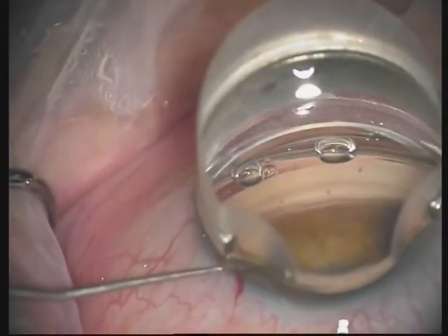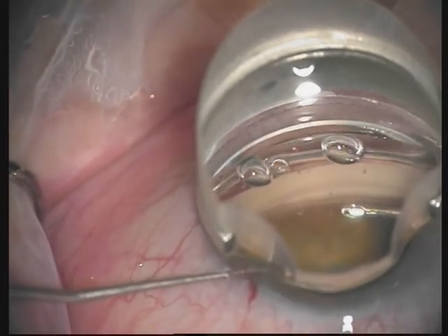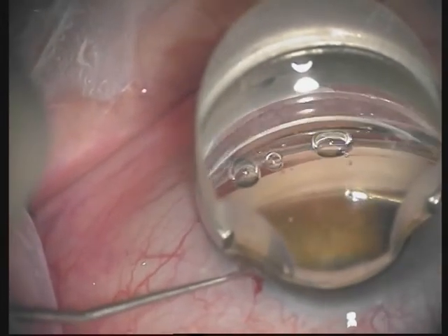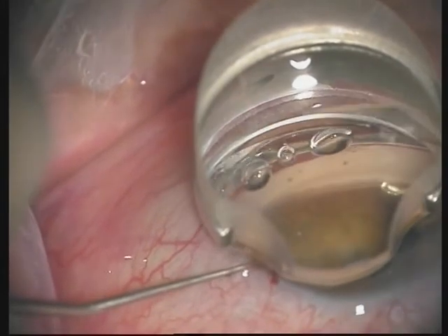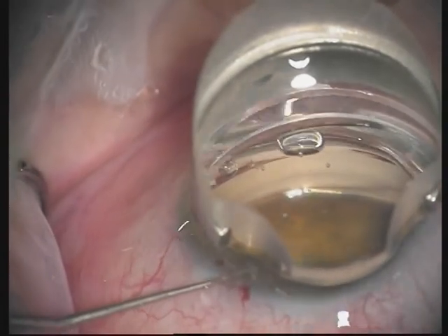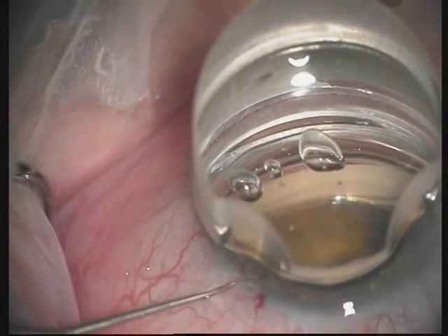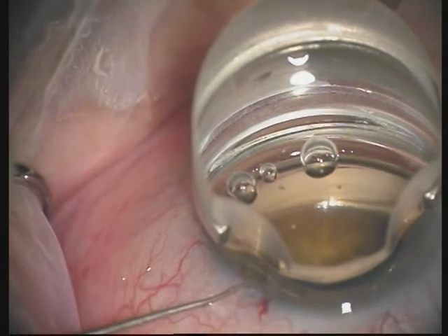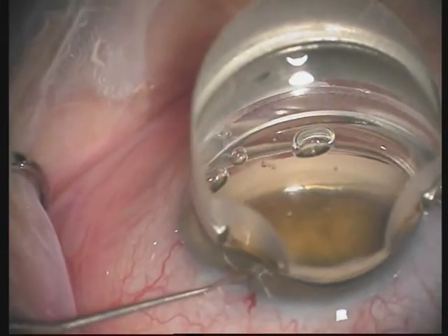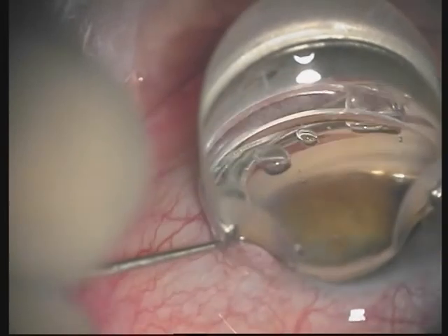In modern minimally invasive glaucoma surgery, a stable and clear intraoperative view of the anterior chamber angle is mandatory to identify anatomical landmarks. In this case we would like to show the implantation of a new implant for trabecular bypass surgery. The Hydrus is a flexible implant made from nitinol to scaffold Schlemm's canal over a distance of about 10 millimeters. It is implanted ab interno with the help of a specially designed inserter. The proximal end should be placed so that the opening is in the anterior chamber, allowing a bypass between the AC and Schlemm's canal to reduce resistance to outflow.